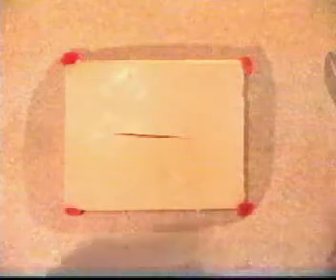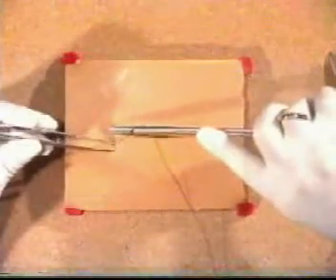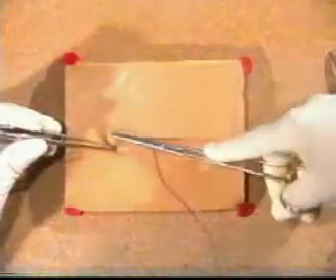I will now demonstrate the essential role of the assistant in the assertion of a continuous suture. Start once again by inserting the initial suture and ligating this using the reef knot technique.